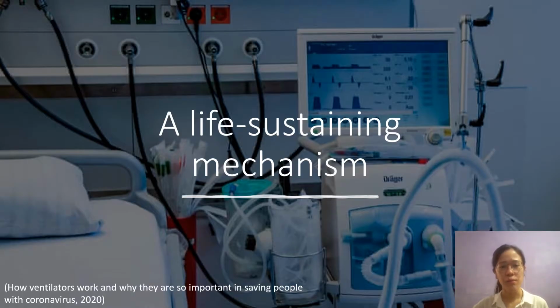As we all know, mechanical ventilation is a breathing support mechanism that is normally used in the hospital ICU. It can help the patient who develops breathing difficulties or respiratory failure to sustain their life by maintaining the breathing mechanism. Especially during this pandemic, the need of ventilators has risen to support severe COVID-19 patients, ensure them getting enough oxygen as needed while the body is fighting against the disease.